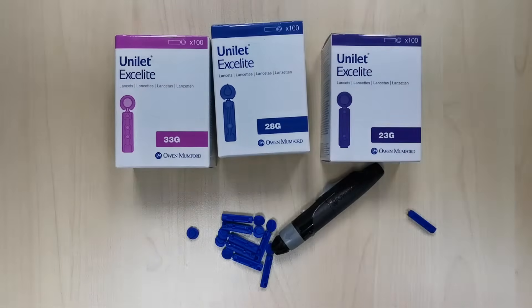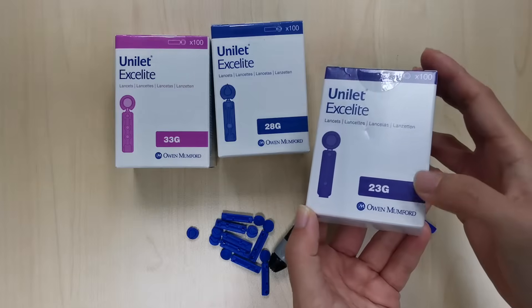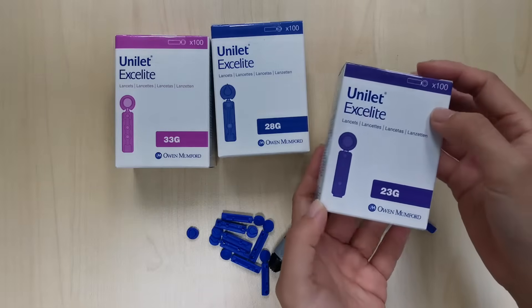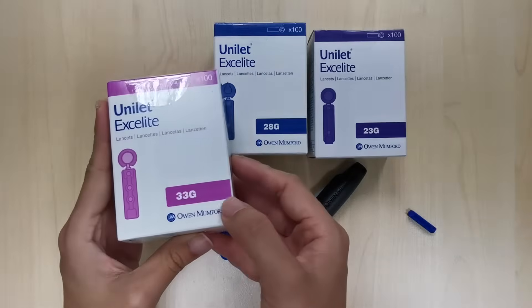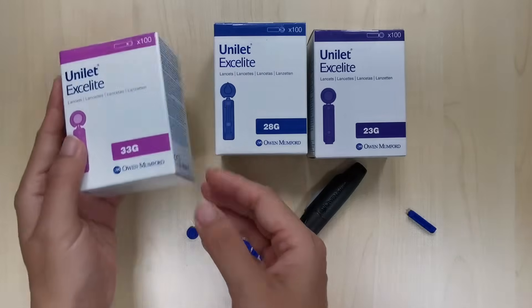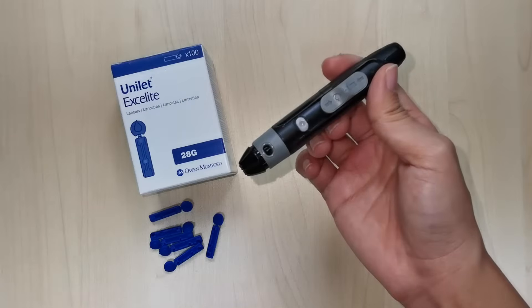There are also other sizes such as the 23 gauge, which is a thicker needle — it's for you if you have thicker skin and need a bigger puncture to get enough blood. Or 33 gauge, which is a thinner needle, ideal for young children or adults with thin skin who only need a smaller puncture.